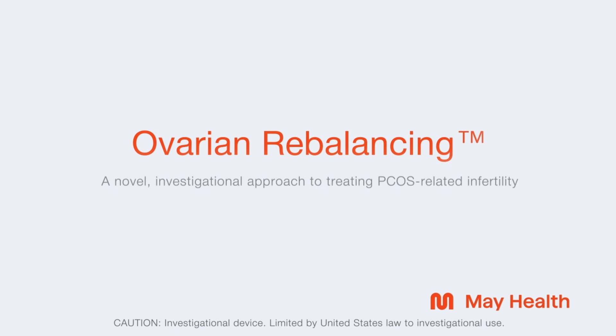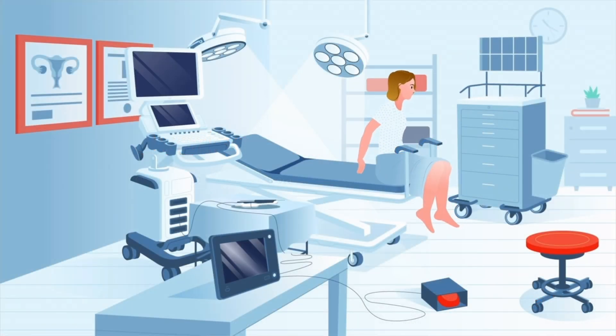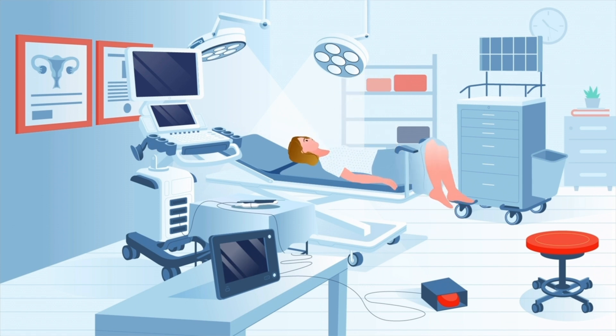The Investigational Ovarian Rebalancing Procedure aims to restore ovulation in women experiencing infertility due to polycystic ovary syndrome, also called PCOS. The one-time, minimally invasive procedure can be performed in a doctor's office under conscious sedation.